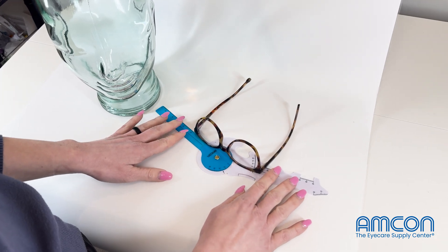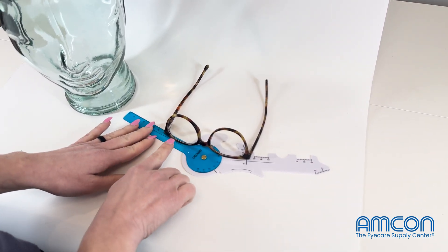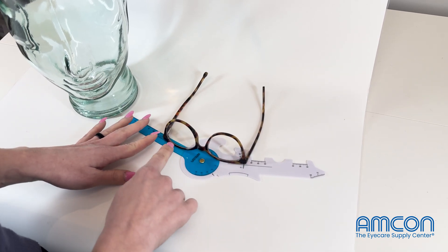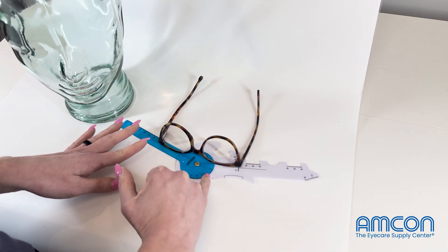You'll want to do your face form first. You're going to line up your frame with the lines on the ruler and get your reading there.